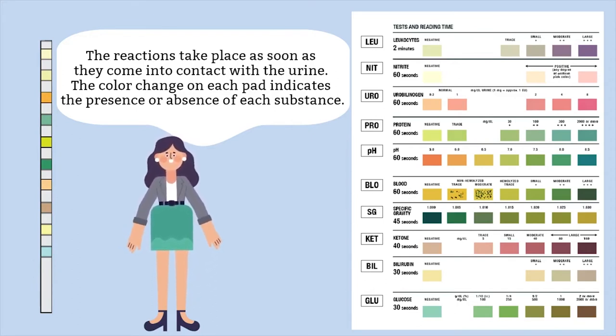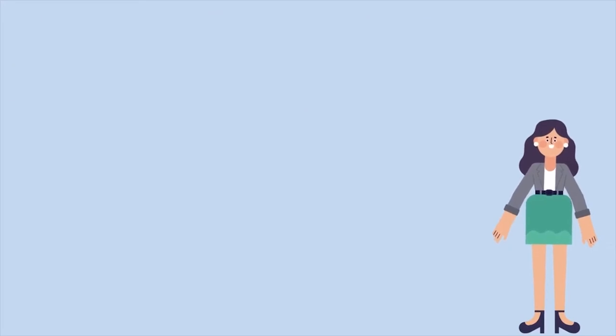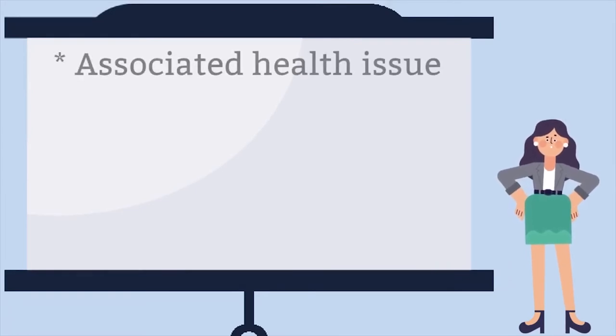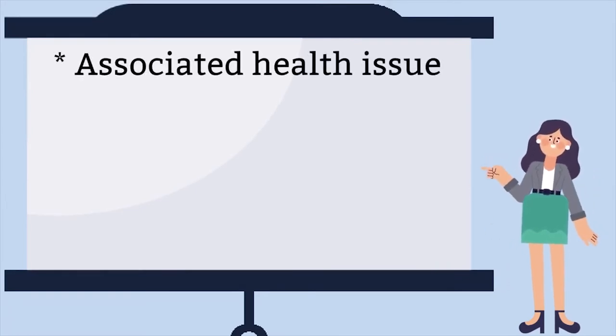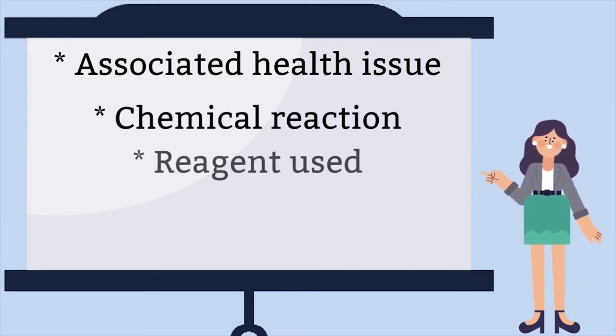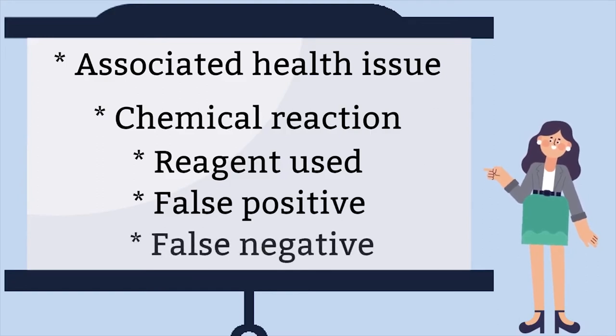If you read the reactions too early or too late, the result will not be accurate. Now that the general information is out of the way, we can go over each reaction in a little bit more detail. So for each test, I will cover health issues that are associated with it, chemical reactions, reagent used, and what can cause false positive and false negative for each of these tests.